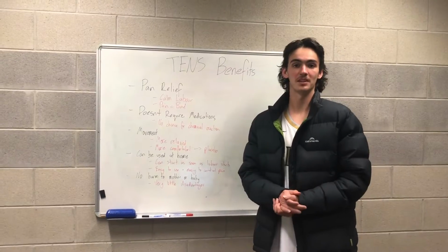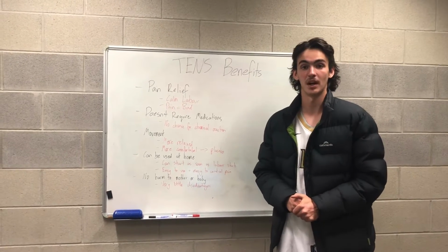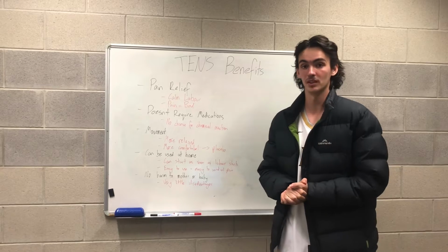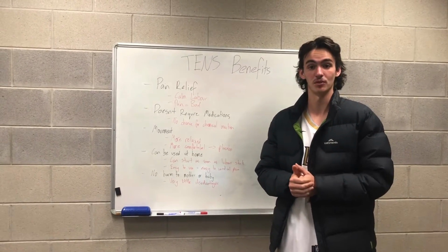Moving forward, we're just going to be having a look at a few of the benefits that patients going through labour will experience by using a TENS machine. In particular, our example, Gertrude.